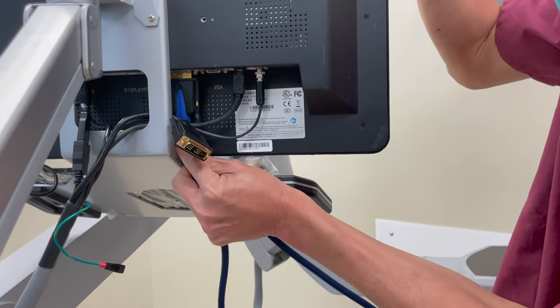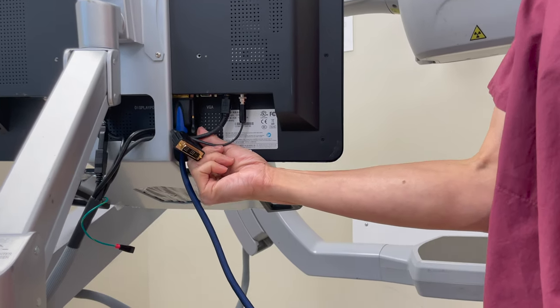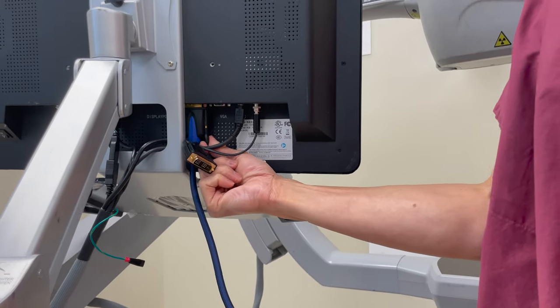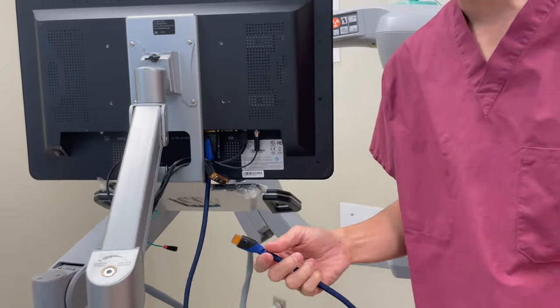The little bar on the cable goes to this side — you can see that if you look underneath — just so you know which way to turn your DVI cable. Then you secure it with these little screws here so it doesn't fall out by accident. You don't have to do both sides and you don't have to tighten them that hard.